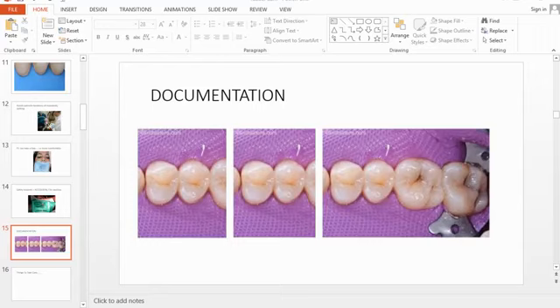You can think that this outbreak has given you a chance to apply it in every patient, because most of the time when we start with a rubber dam, we are not comfortable and we think that our patient will also not be comfortable, so we don't use it. So now you know the importance, not only for your ease of work, but also protection to the patient and the droplets which are there from the aerosols. So you know the importance, guys.